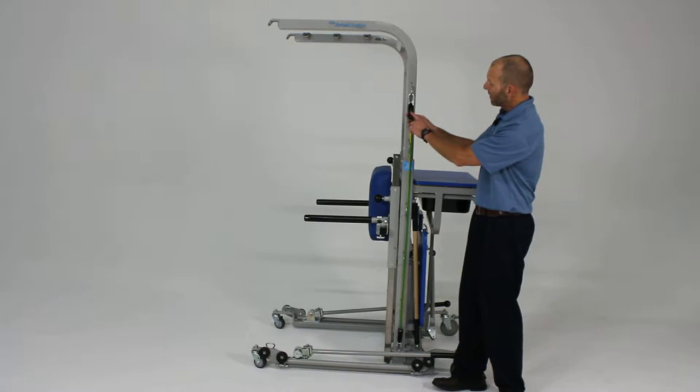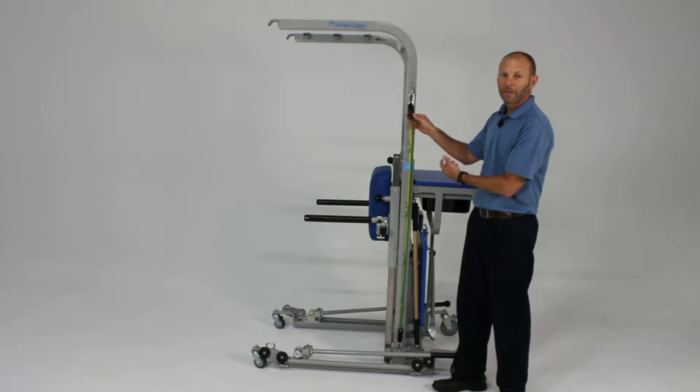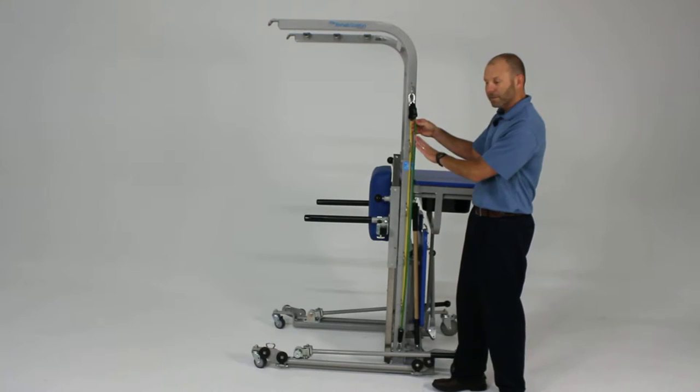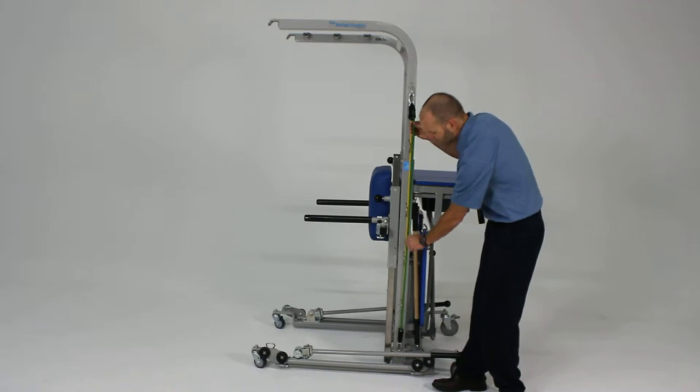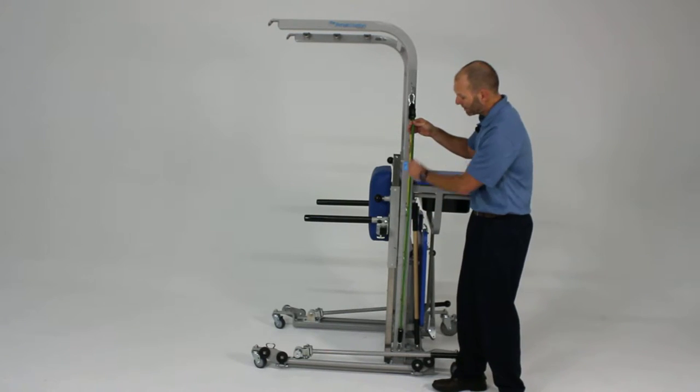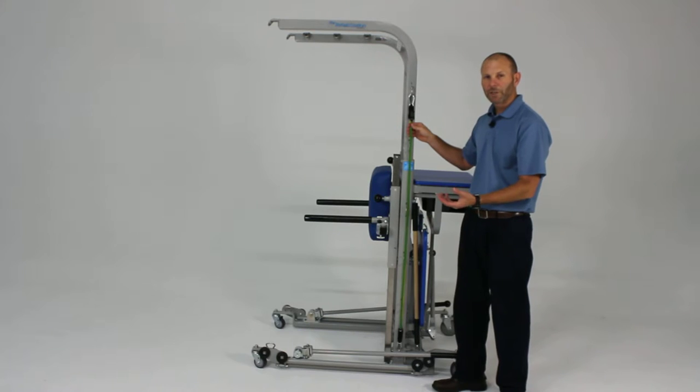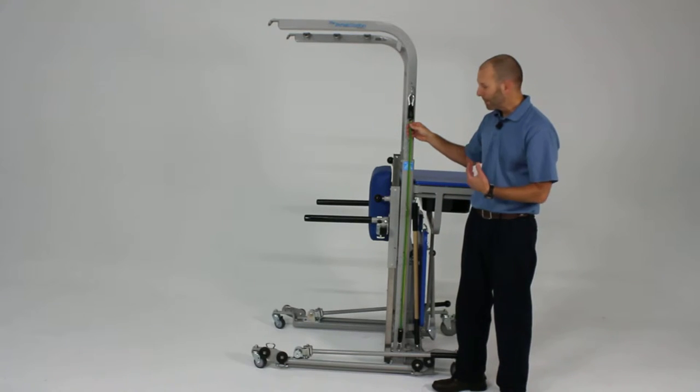They're identified by the approximate amount of poundage that they provide resistance for. The unique thing about these elastic cords is they have a safety fiber that extends the length of it, preventing overstretching and, if it were to break, preventing it from snapping back.